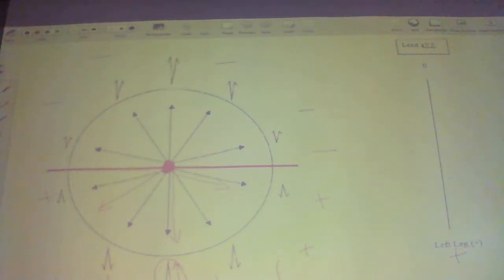Now, what will change is the amplitude or the vertical displacement of that QRS complex. In other words, as we start moving away from lead aVF, but still in a positive manner, the amplitude of that QRS complex tends to become smaller than it does if you're heading immediately in the direction of that lead.